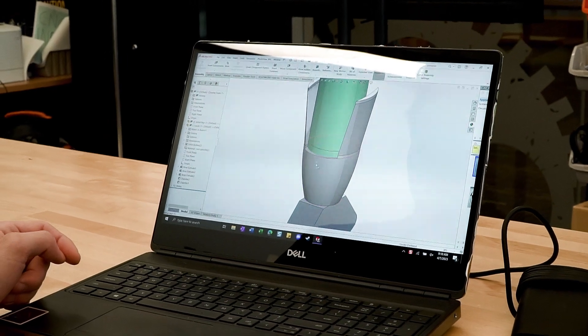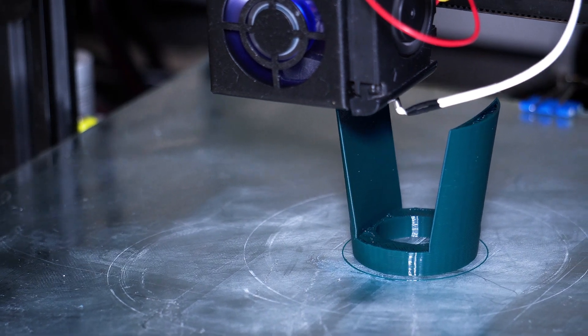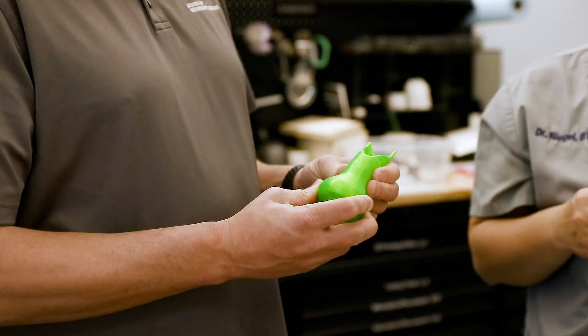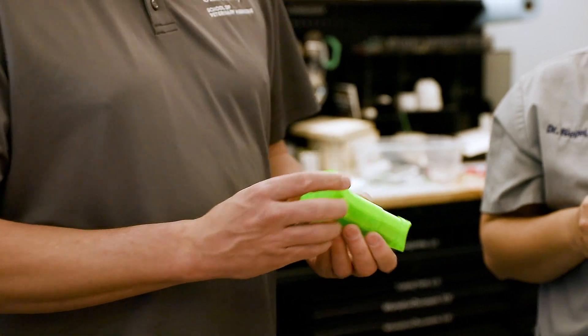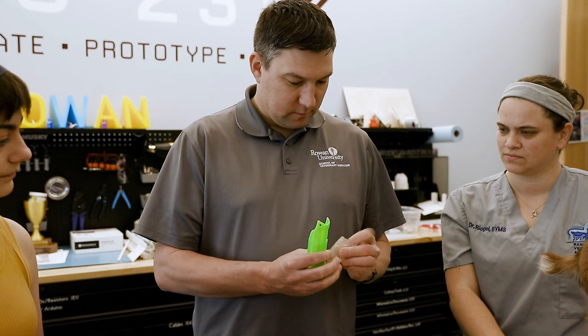We definitely wanted to figure out how to make this durable and comfortable at the same time, so we researched different materials — both what we have here and what engineering has. The concept was pretty right from the beginning: we just needed to extend the back legs and give this goat something to walk on. It was making refinements to keep it in place that were really important to the project.